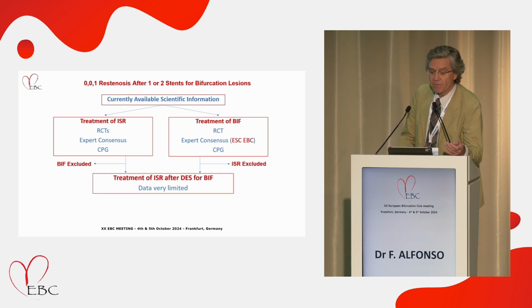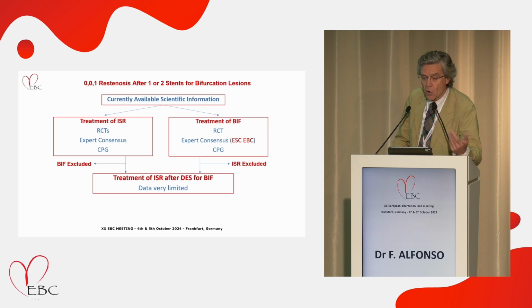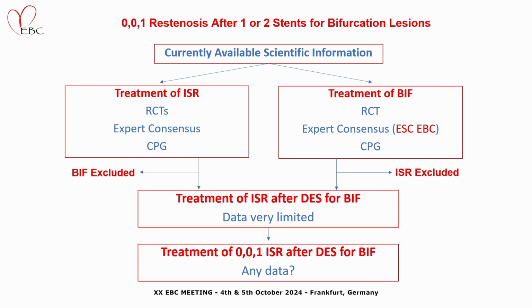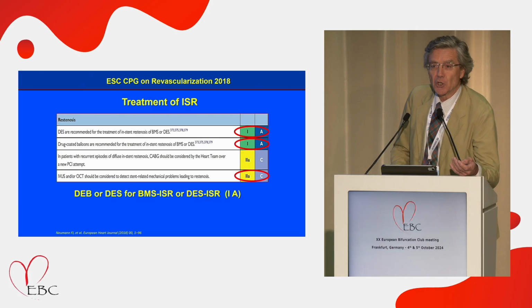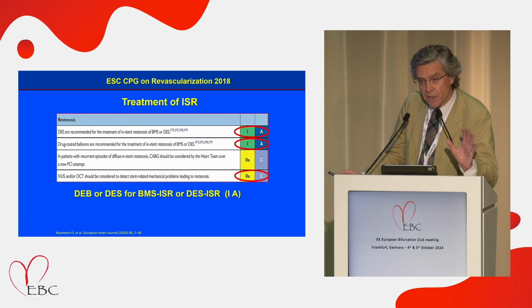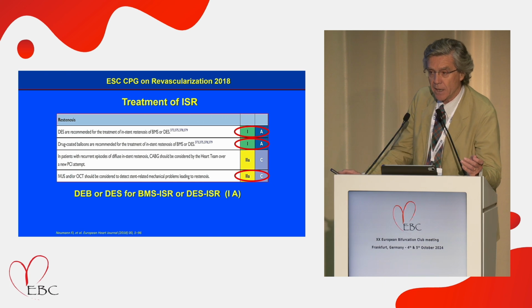So there is very limited information on how to treat ISR after drug-eluting stent implantation. And if we just concentrate on the 001, well, virtually there is no data. And this is why I was not so happy when I was trying to prepare the talk. So what I will do is just present a general overview of the information available, and hopefully you won't be too disappointed.